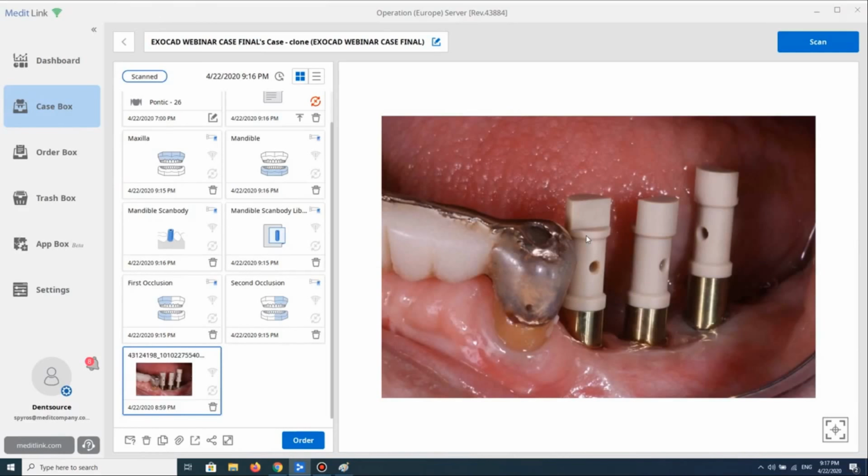The second step that you should have in mind is that you need to make sure that you have sufficient space between the implants in order to scan perfectly all the sides of the scan bodies. So sometimes it is a bit better and more convenient for you to scan with fewer scan bodies than the number of the implants, because you will have a sufficient distance between these two in order to rotate your scanner and put the head here. So it will cover this area or this area, or basically any area you want, because you will have the space here. Okay. In a case like that, as you can see, the space here is very small.